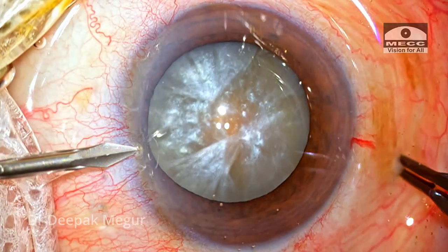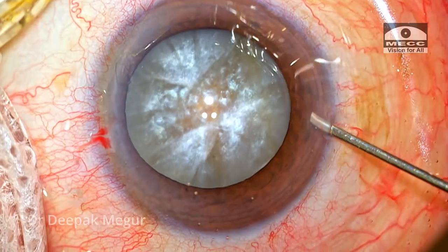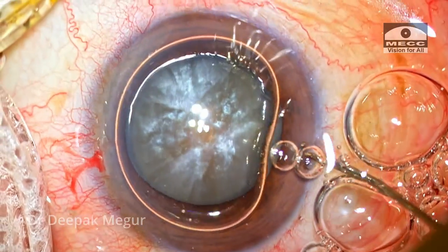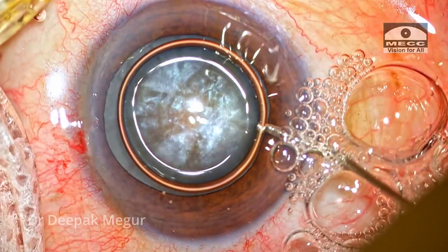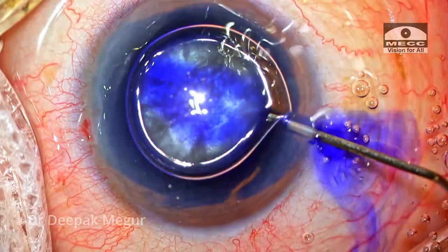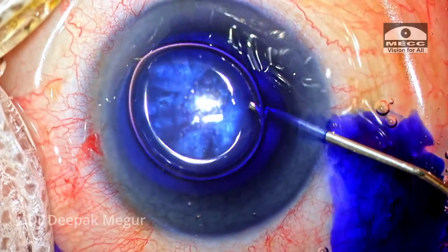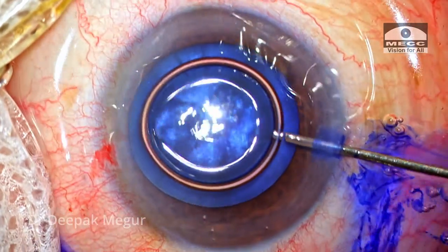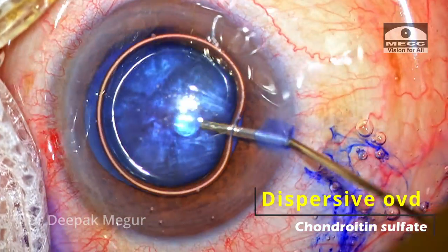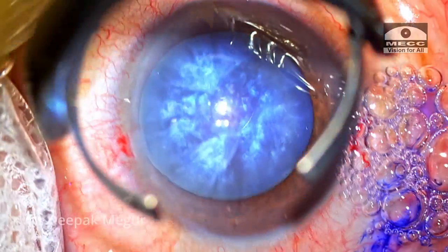The side ports are made. Intracameral lignocaine is placed inside the eye, followed by staining of the anterior capsule under an air bubble. Dispersive OVD containing chondroitin sulfate is used to pressurize the chamber, and then the main incision is created.